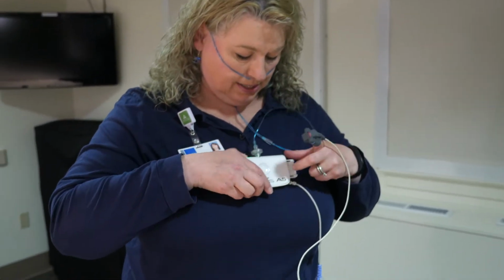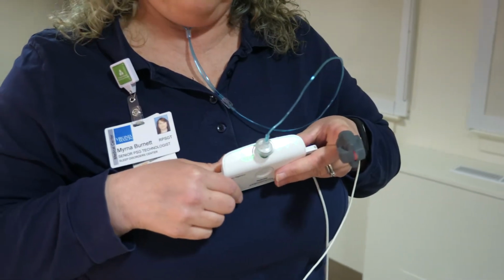This will do 2 things. It will hold the cannula in place and immobilize it so it won't wiggle around and tickle. You'll notice when you first go to put it in with those nasal hairs in your nose, it will tickle and you'll want to take it right back out. So just bear with it a few minutes and you'll get used to it. Okay? Once all of the sensors are in place, the unit itself will be all lit up green.